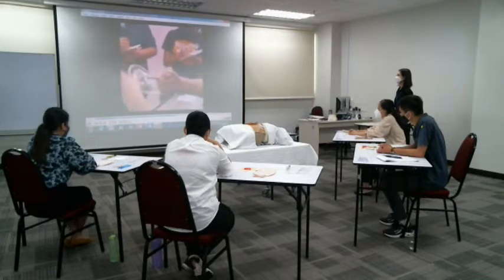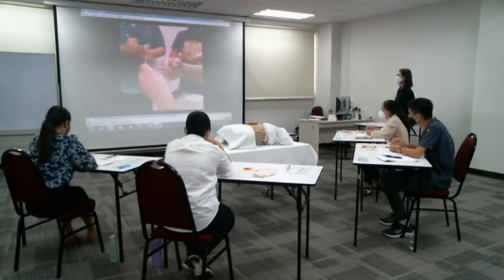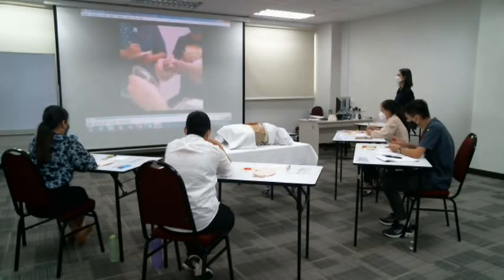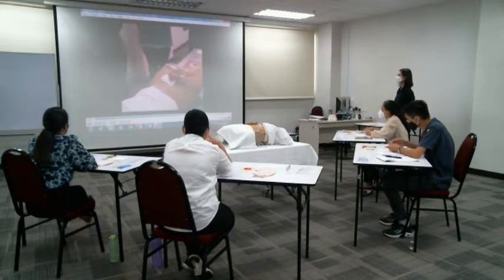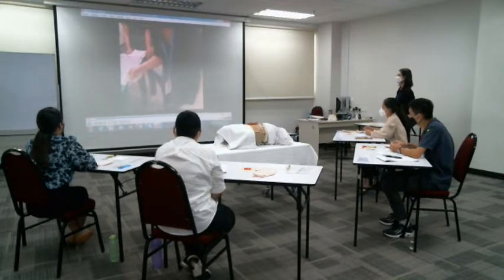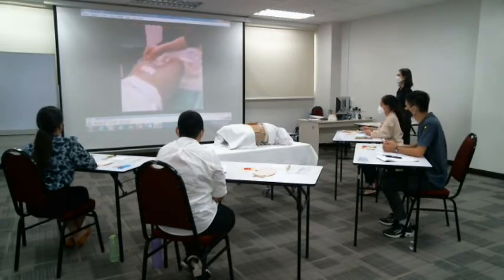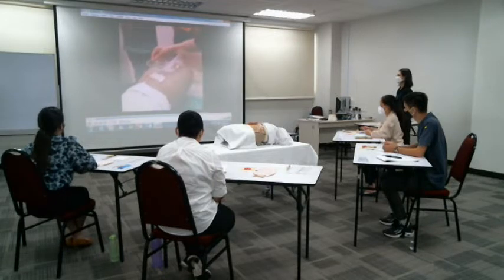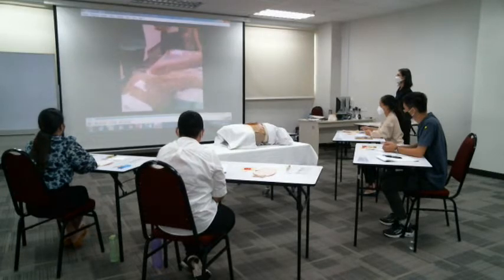Later on, we are going to do the cutting. Cut along the mark. And after that, I'm going to take the paper and see, because just now I placed it like that. So I have to put it this way, just up and up. Must be the same position. Okay, so we will.